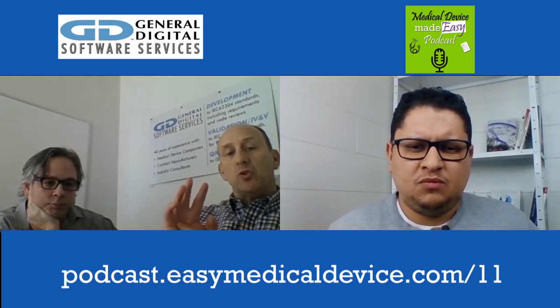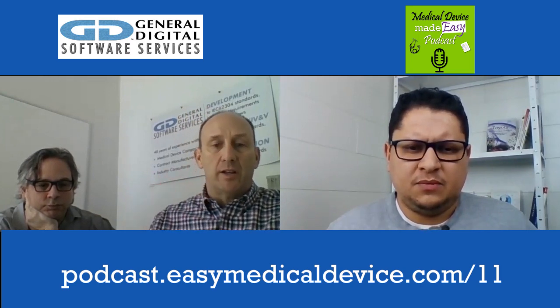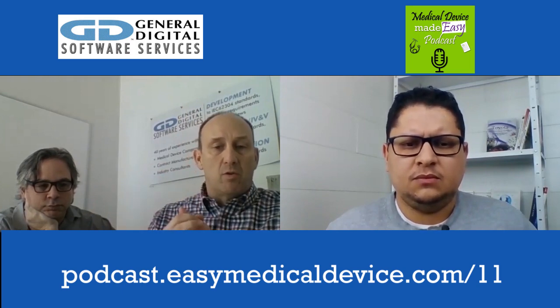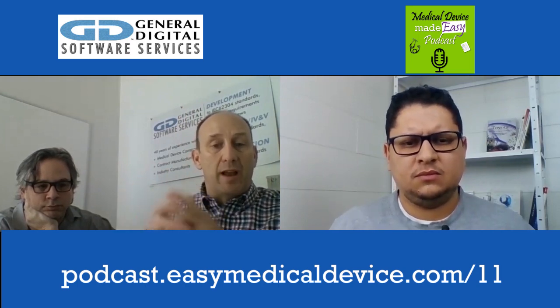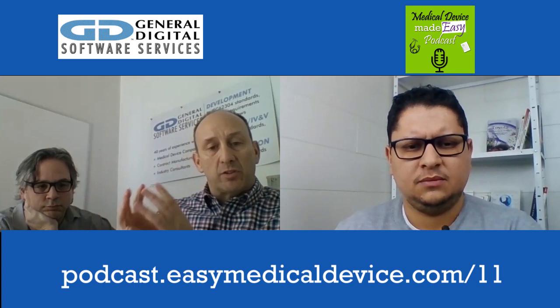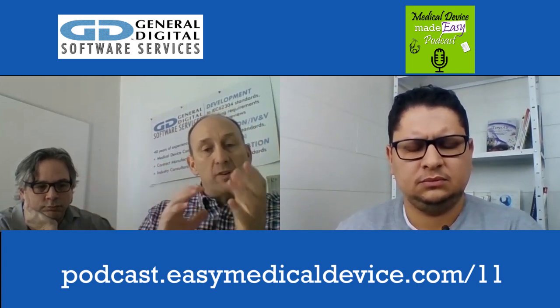So there are 2 parts to AI that on the front lines when I talk to customers, there are 2 types of AI, I'll call it. A device itself can go through algorithms and it needs data through testing in order to prove out that it works, and that certain tests it's performing are proven out over thousands sometimes of different tests that the device performs. Then there's AI, artificial intelligence, where it's just a software standalone device, where that's all it is, just an AI device. So there are some different versions to that.